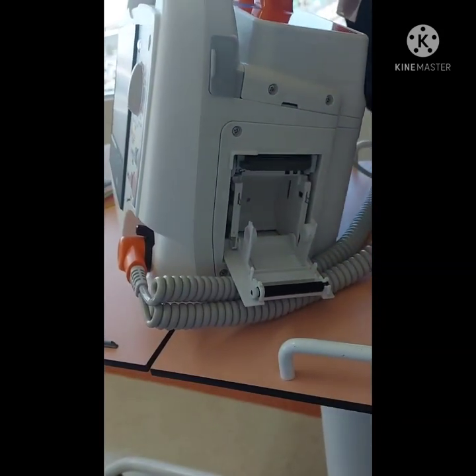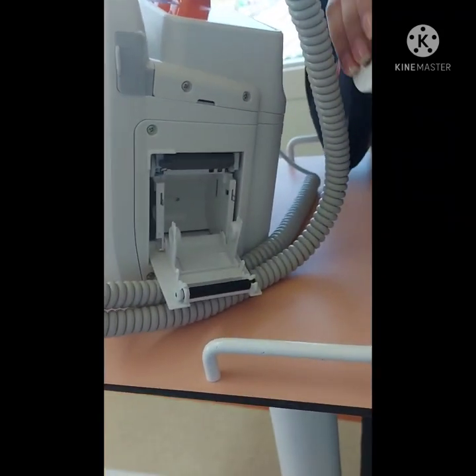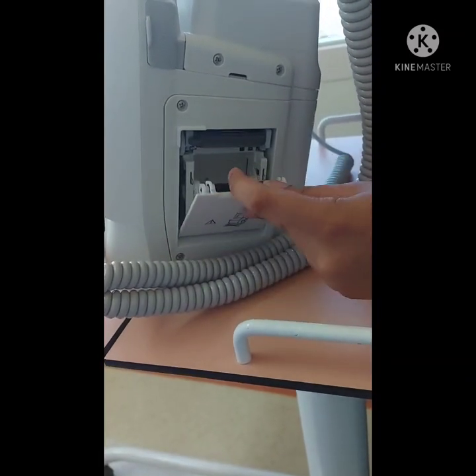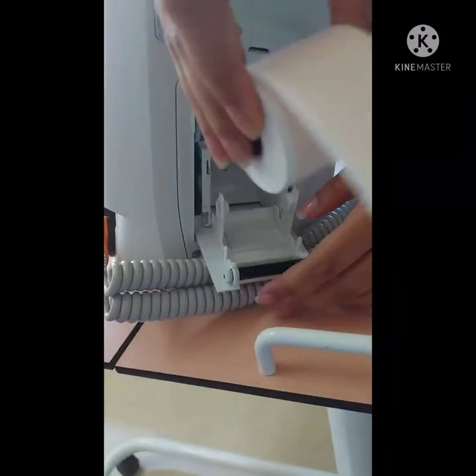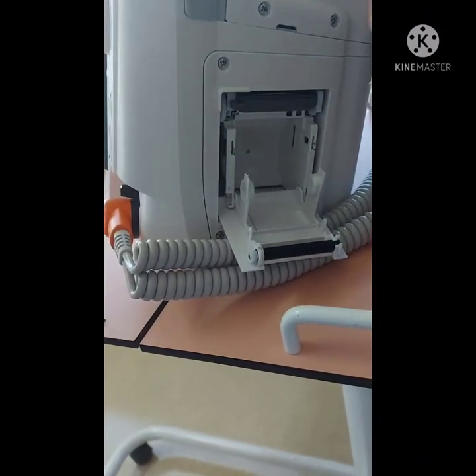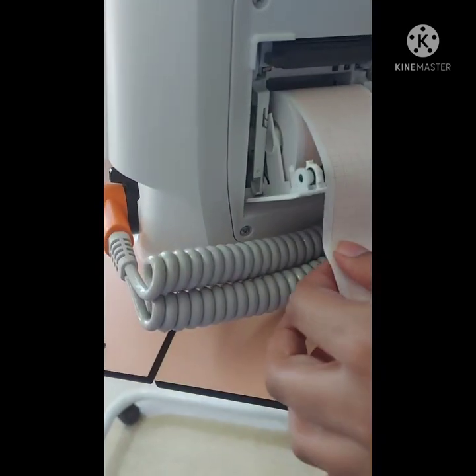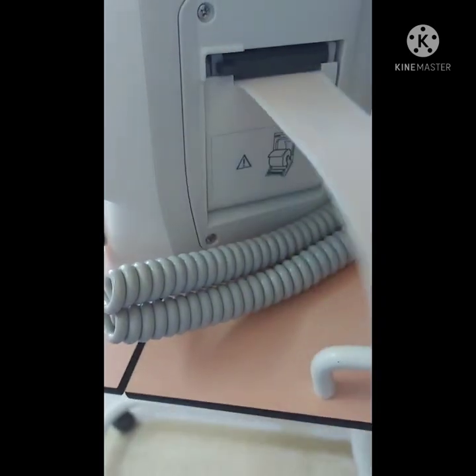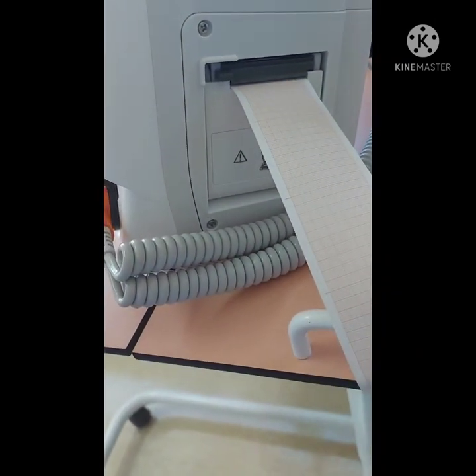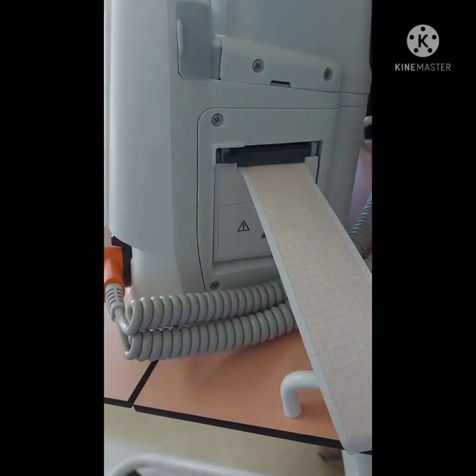So you just have to make sure that the orange side is up and the paper is in between these spaces. Okay? And it's thermal printed, so you don't have any ink or anything. You just have to put it on the side, then make sure it is in the middle, then just close it. The same line should be there. Okay, so from the side, that's it.